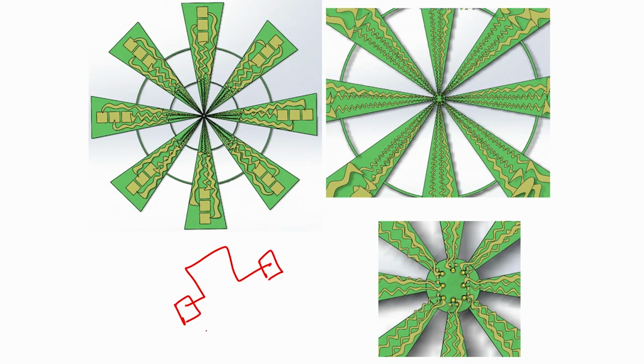We require 2 contact pads, 1 and 2, and then on that there is an insulator on which there is an electrode, and that electrode consists of an SU8 pillar. This is a top view, it looks like this. Somewhere your electrode is like this.